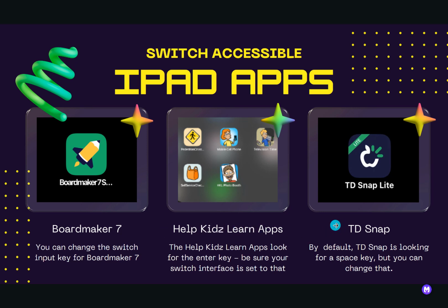And then many students use the app TD Snap for communication. So by default, TD Snap is looking for a space key. But again, you have the ability to change that if you have a switch that is programmed to give a different keystroke. For example, the enter key.